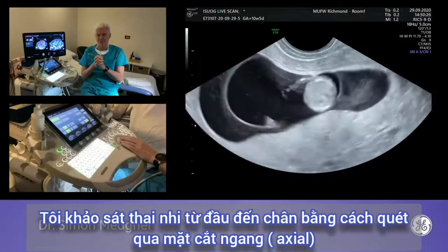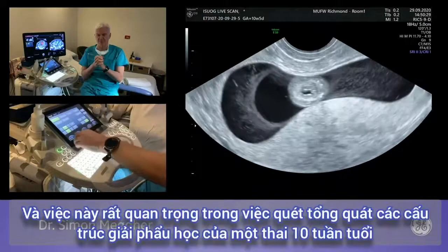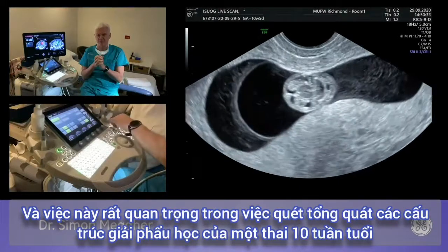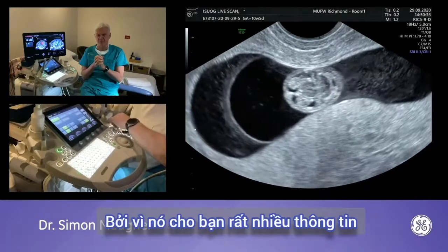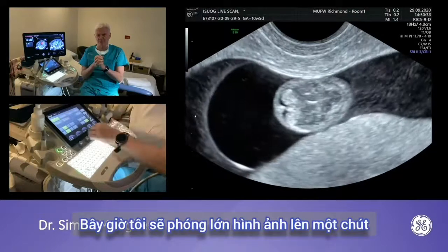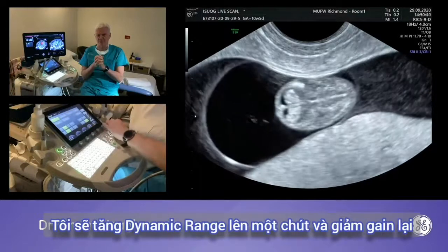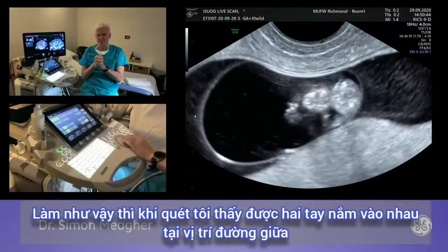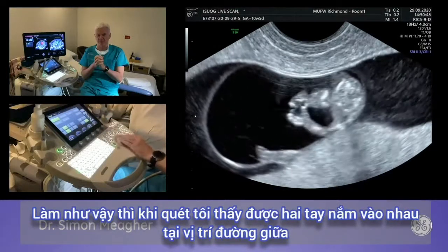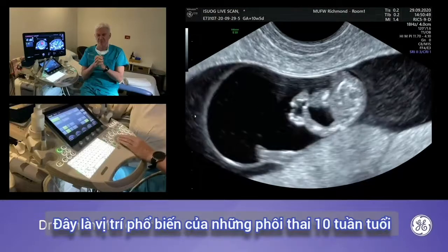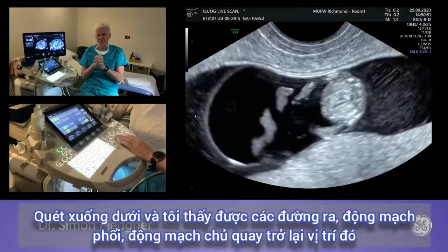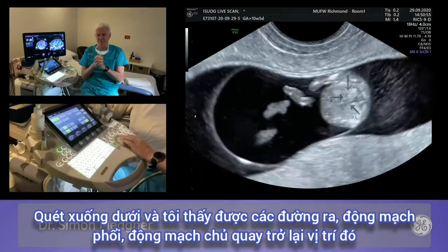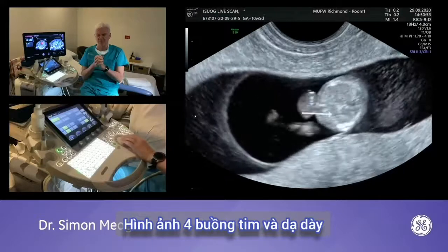Performing an axial sweep from head to toe gives a lot of information at 10 weeks. After slightly zooming and adjusting dynamic range and gain, I can see both hands held across together in the midline — a very common position at 10 weeks. Sweeping down, I see the outflow tracts: the pulmonary artery, the aorta — I'll return to those — then the four-chamber heart view, and the stomach.